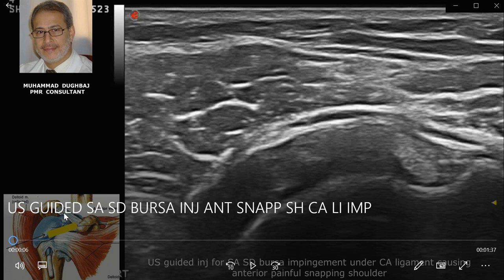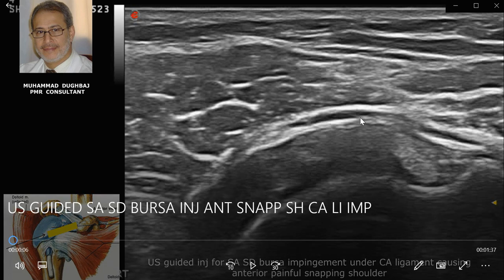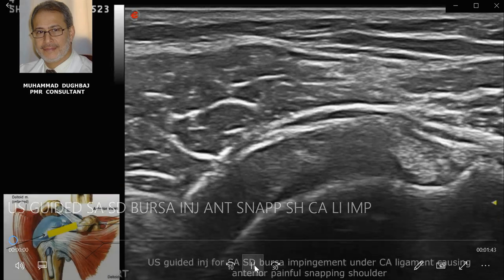We will demonstrate this with dynamic sonography, which is superior to MRI because you can visualize the pathological tissues — specifically the subacromial subdeltoid bursa hypertrophy — and observe the snapping and bulging of it.